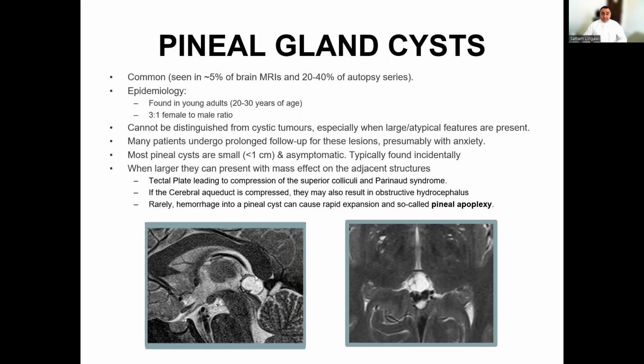Although it is usually simple, cystic, unilocular, and maybe containing some simple septae within, if it contains some solid components, it gets confusing to differentiate it from pineal gland tumors and may warrant follow-up MRIs, particularly if the size is bigger than 1 centimeter or has atypical features.